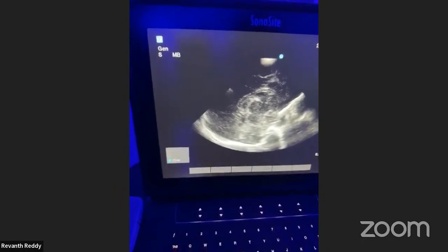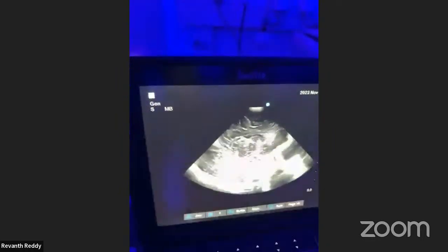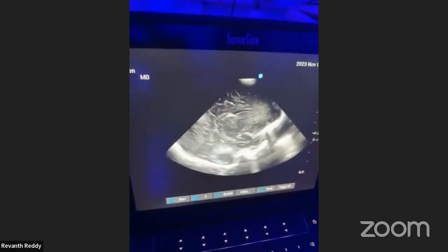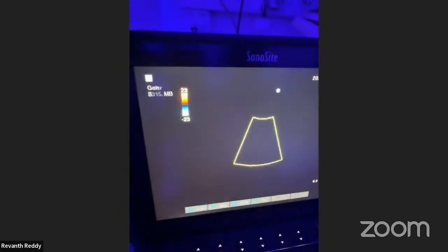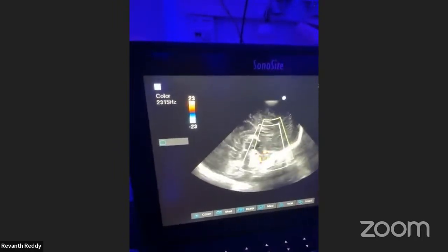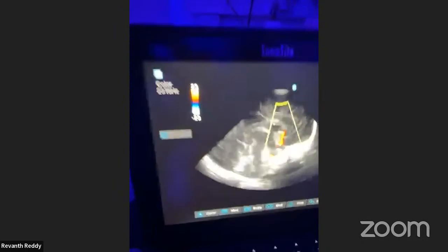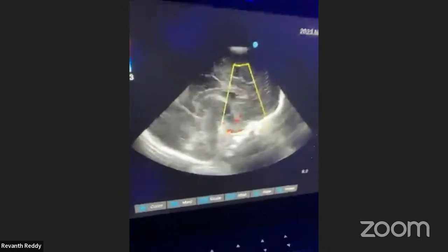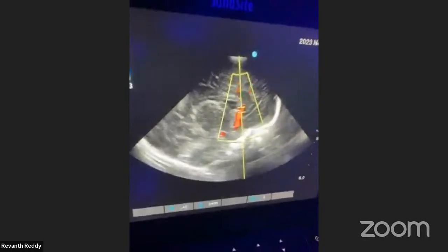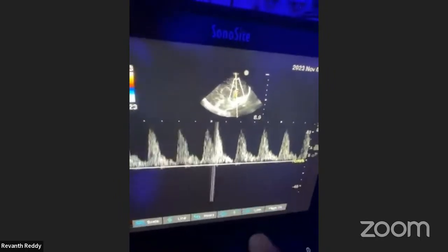Okay, so meanwhile, you have to be monitoring the vitals of the baby also. Make sure that the baby is calm and not agitated. In the sagittal view, we will try to look for the Doppler. So, I will just try to put color over here. So, you can see the ACA clearly. Now, we will put the Doppler over there. I will put the Doppler again. So, here you can see clearly the systole and the diastole.